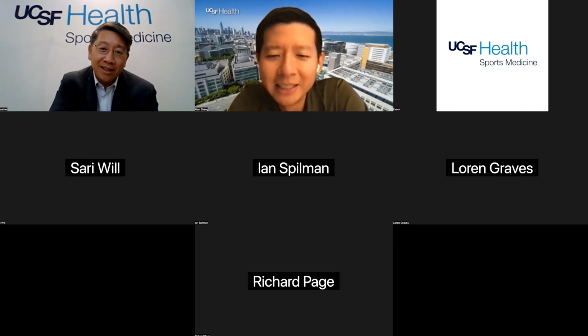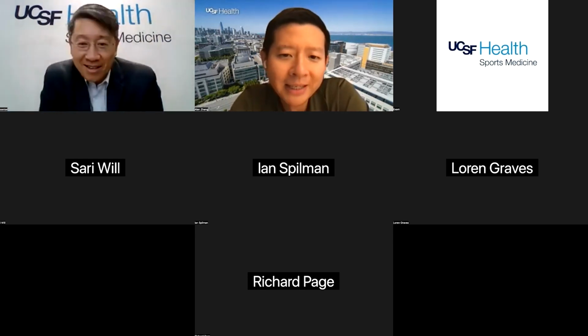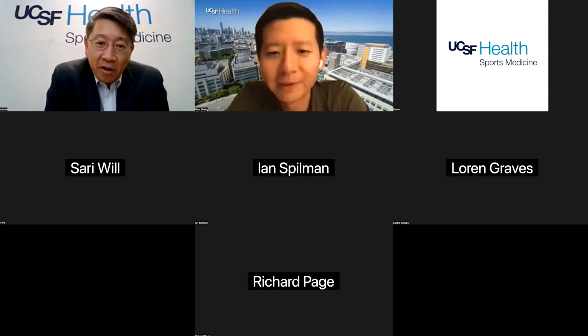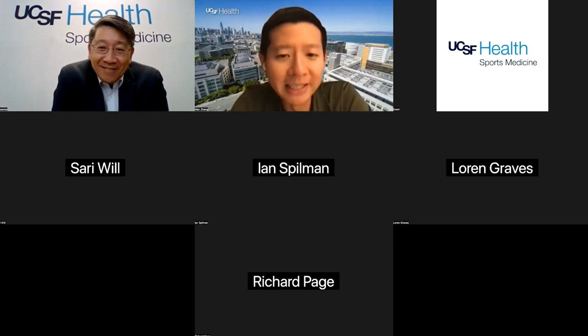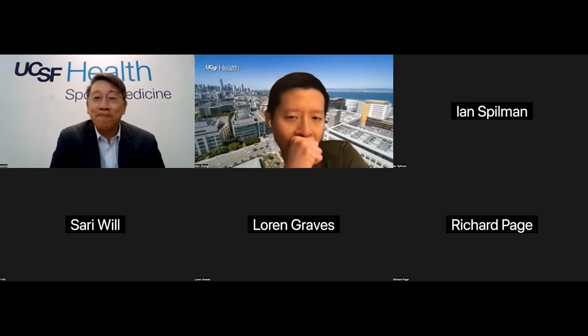So I think the other question is if their BMI is too high, what do you do? So then you can also try to do an ultrasound, especially if it's a tendon injury, like the shoulder. Ultrasound works really great for that. Even hamstring injuries, ultrasound has been pretty good for diagnosing those as well. What about meniscus tears and ACL? Can an open MRI pick that one up? So you could probably get an ACL tear from an open MRI, but a meniscus tear, it's very hard to tell from an open MRI.